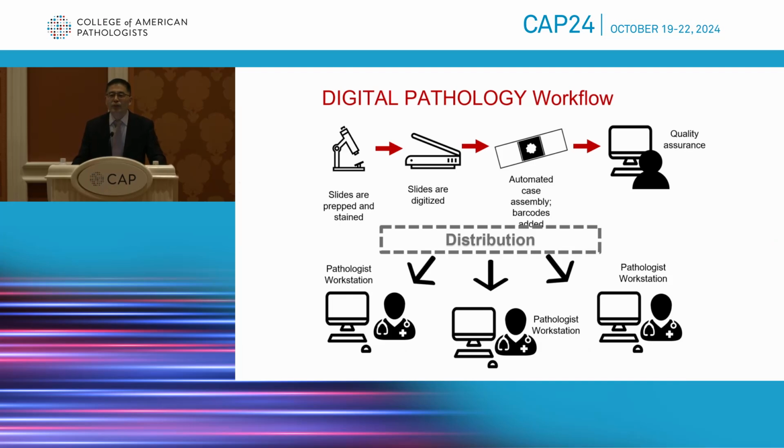Before we can even use or develop these AI tools, specifically in pathology, we need the digitization of our slides or our material. So we need the digital pathology implementation, and we need this workflow in order to use these AI tools. In this workflow, you need to scan those slides and put them in your IMS, image management system. Then you can implement the AI tools to help you with diagnosis or other tasks.